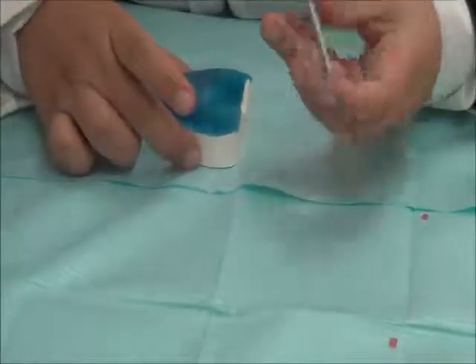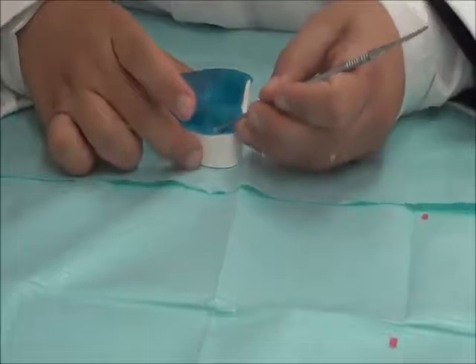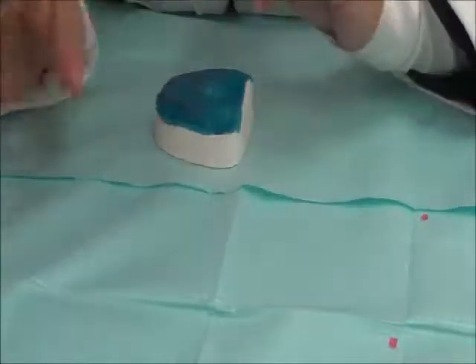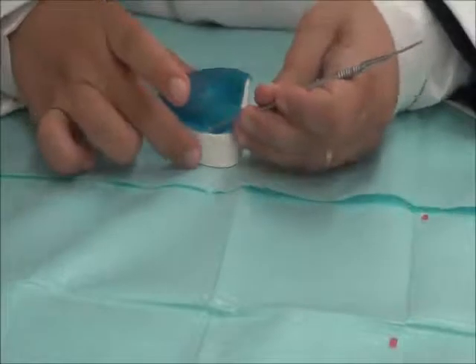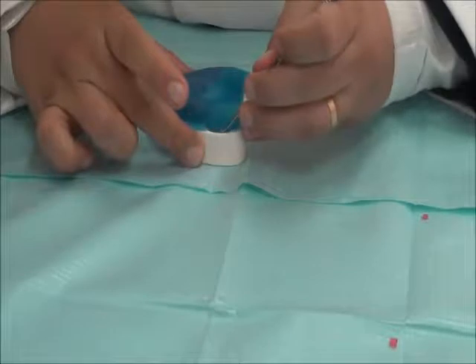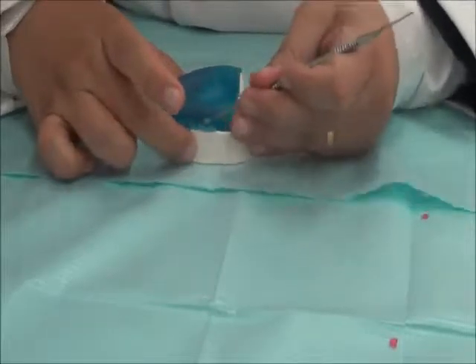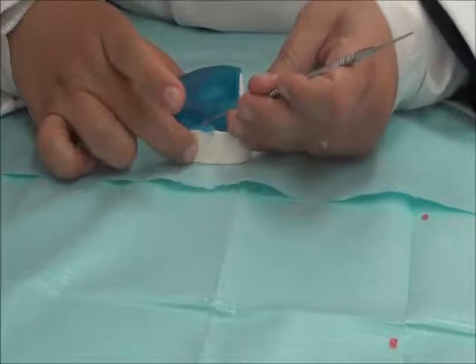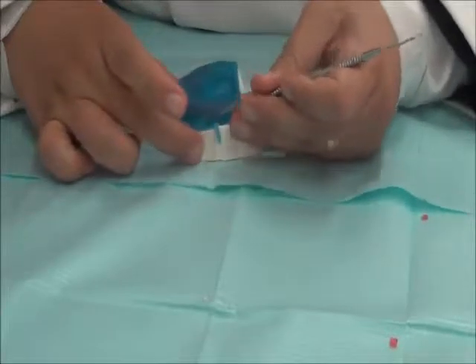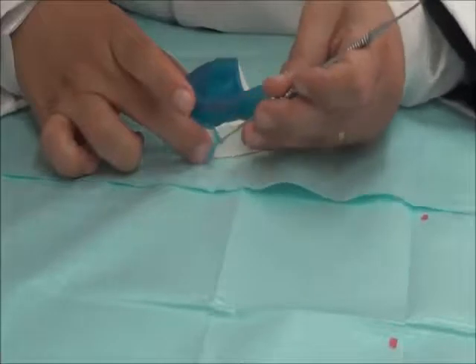and then by the back of the instrument, or even the back of a pencil if we have, we can adapt this material from the outside to the inside of the sulcus and then smooth it. Okay, we make sure it's fully adapted, not pressing it, not thinning it. We're just doing the adaptation step. So we keep the thickness of the material uniform.